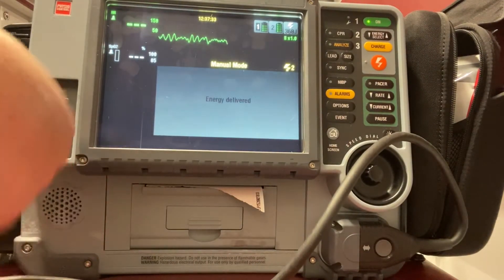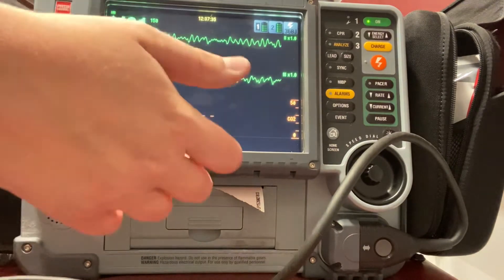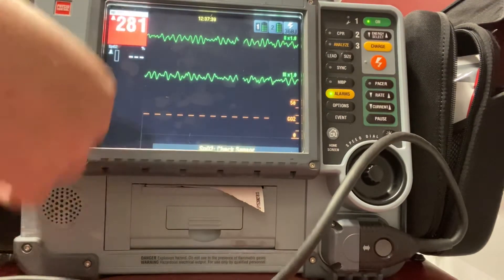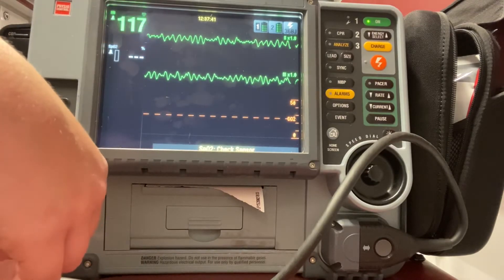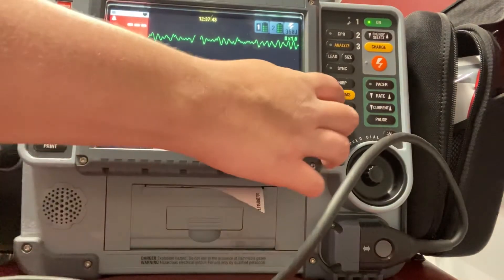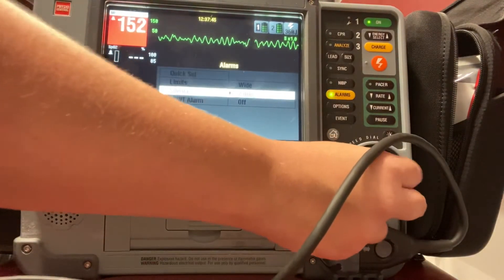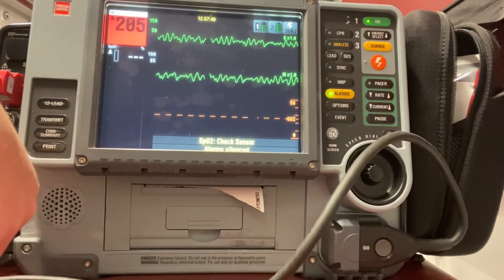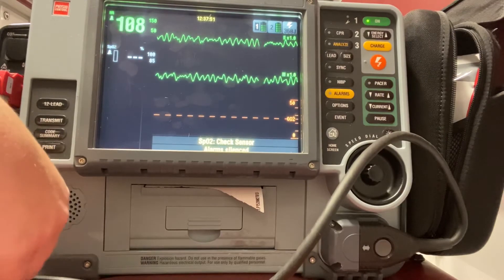We're going to do our five cycles of CPR — two minutes. Go ahead and get those antiarrhythmics, that epinephrine, all the medications — the different interventions we want to do during our cycles of CPR. And after two minutes, I'm going to do another pulse check and rhythm check.